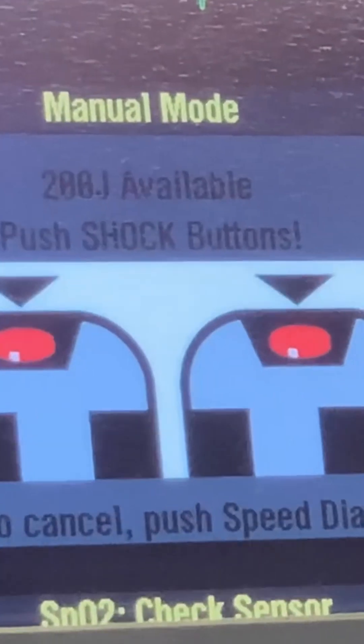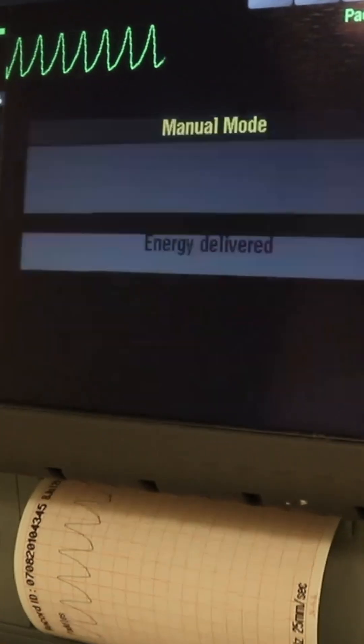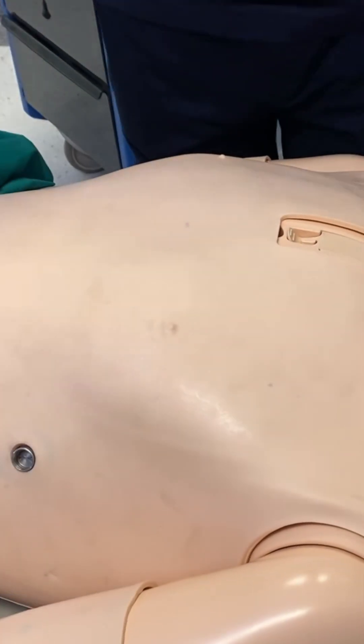I'm clear. Press and hold until the shock is delivered. The machine will tell me the shock was delivered, and I can also observe the patient move when I give the shock. After that, I will not look at the rhythm, I will not check the pulse. I will resume CPR immediately. Shock delivered — resume CPR.